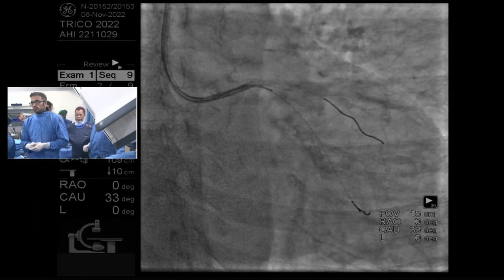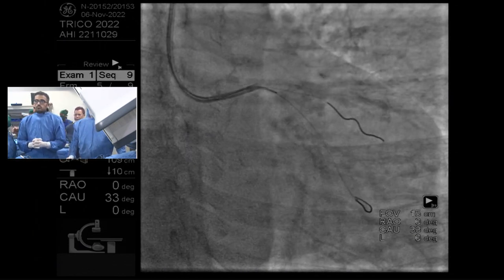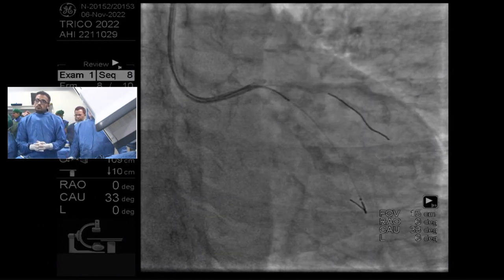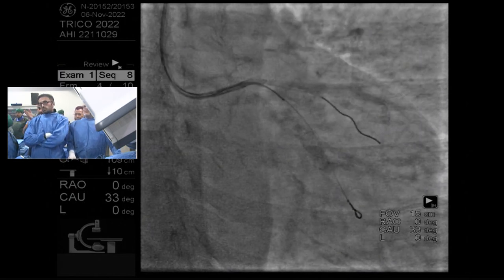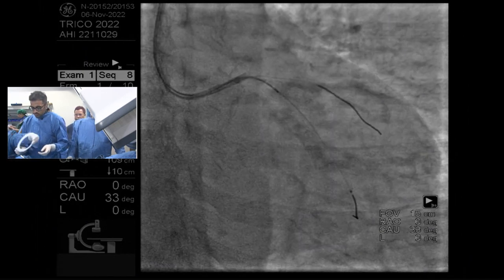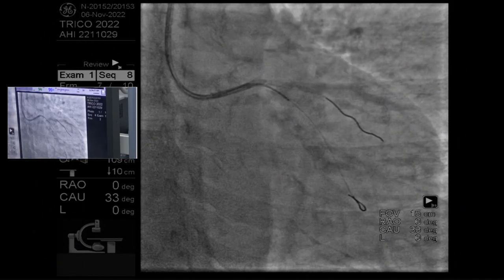Now let's cycle back. So one frame back, please. Okay. So do you see where that proximal marker is? Yeah. Your landing zone is ever so slightly above that. So it's somewhere between those two. So take this now and make this a reference. Freeze it on the side, on that little corner. Perfect. Now all you're going to do is deliver the stent and line up just proximal to that marker and that's deploy. That's right.